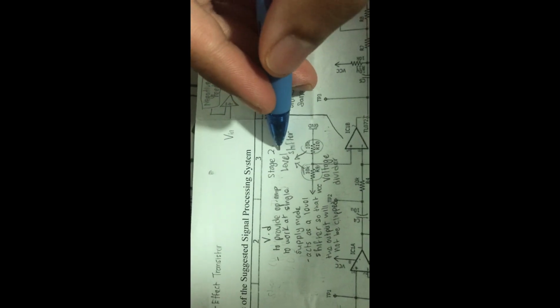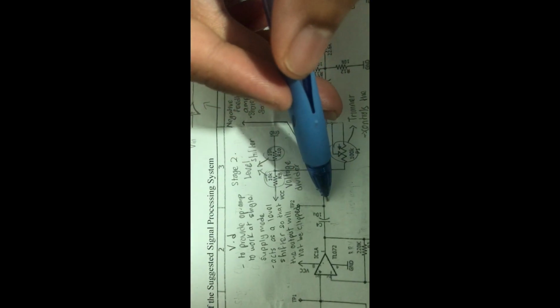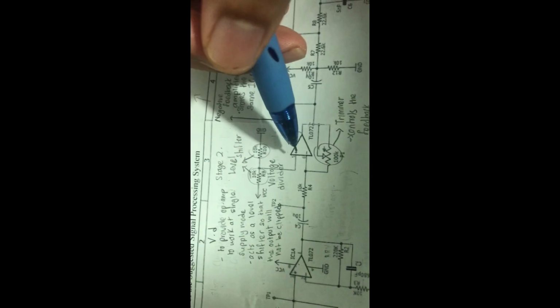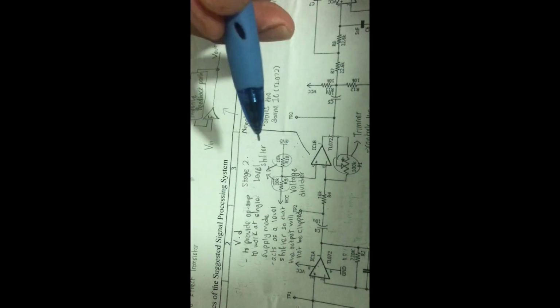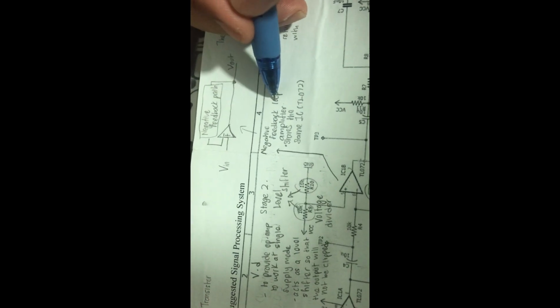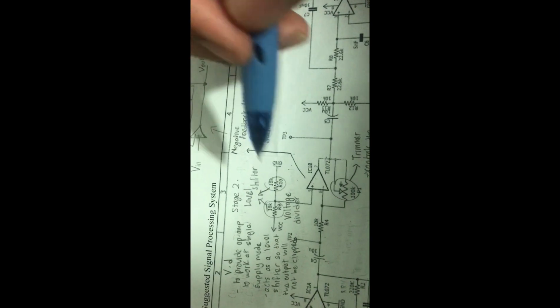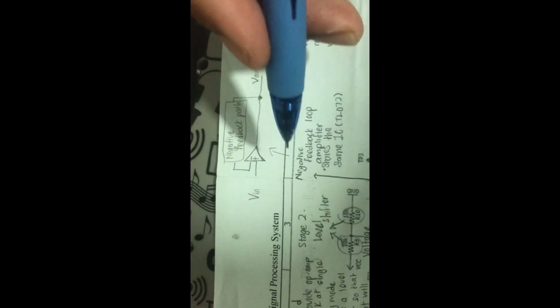Okay, so now we are looking at stage 2, which is from this point, basically this part. This is the stage 2 circuit of this medical device project. What we are looking at here is a negative feedback loop amplifier, which shares the same IC, the TL072, the same IC1. These are both the same ICs. So how does a negative feedback loop actually work?